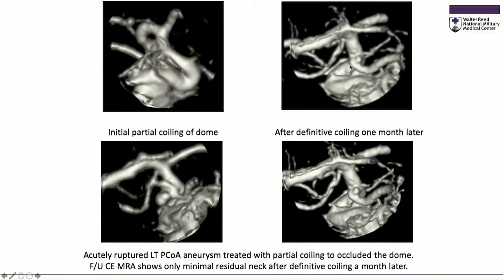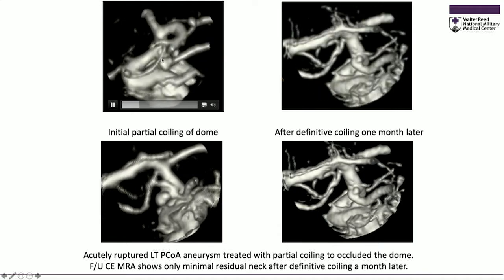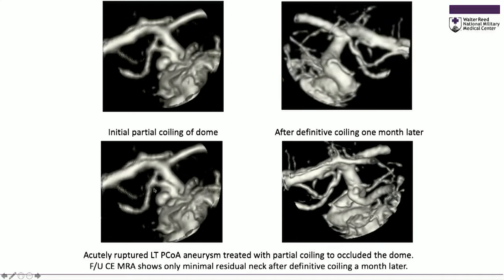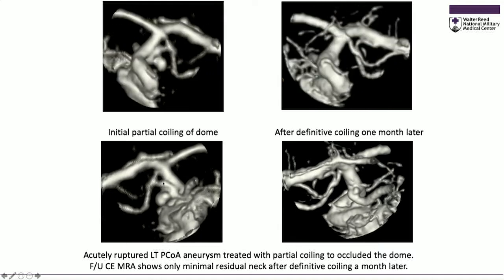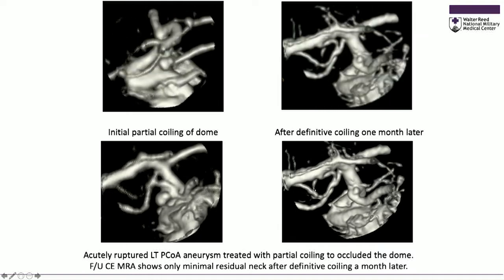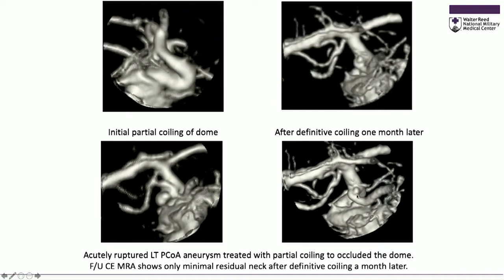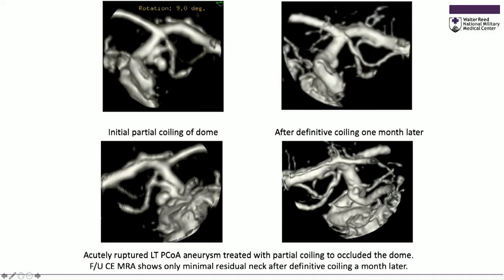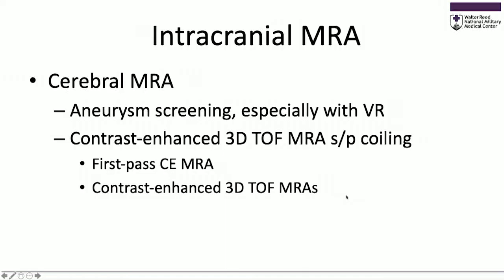And you can see we've basically taken out all of the residual aneurysm. Here was this big, and the coil mass was right here. There were big portions of it still present superiorly and inferiorly. And the only thing that's left is this little nubbin, but we couldn't take that out because this was the big posterior communicating artery supplying the back of the brain and had to stay there.